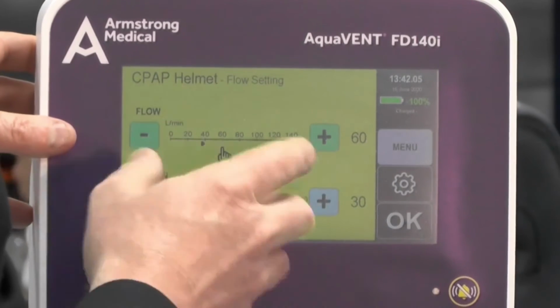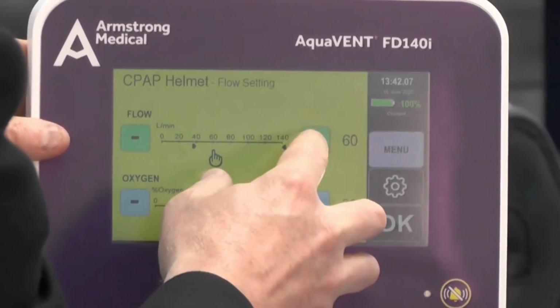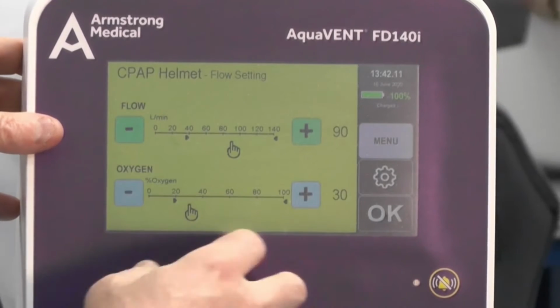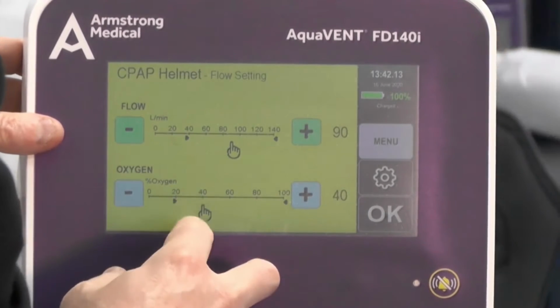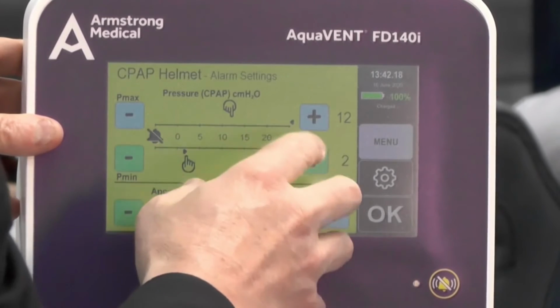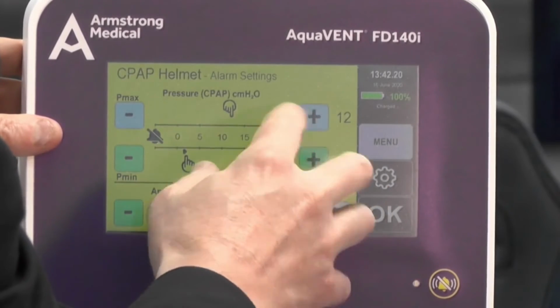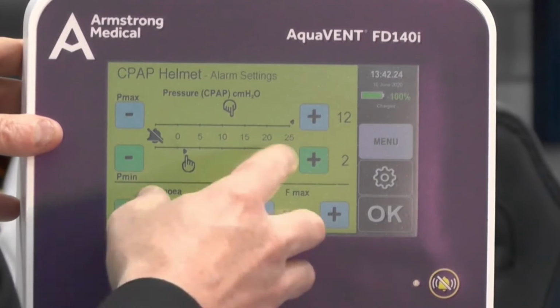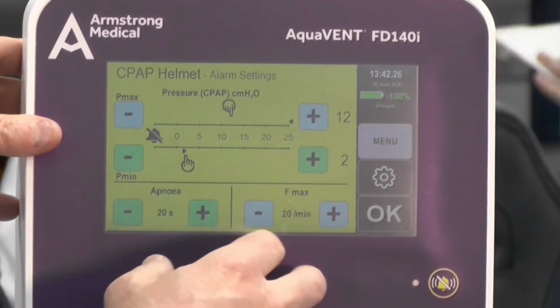Select the flow that you want. It defaults to 60 in this mode, so we're going to put it up a little bit, perhaps to 90. Oxygen percentage, let's put that up to 40. Press OK. We then want to set the alarms, which are a high pressure alarm of 12 and a low of 2. We'll leave that as they are.